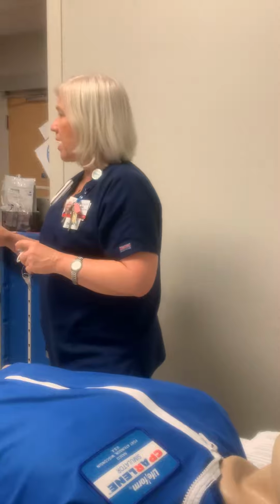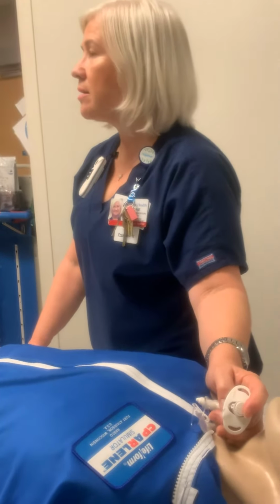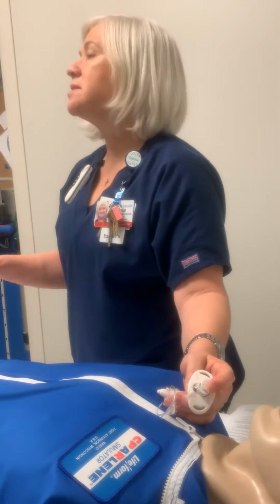And Banner's policy at Gateway is they must have one trach available at all times that is one size smaller than what's in their throat. Okay? So that's our policy here. At the rest of the Banners, they have to have a size that's in currently, but at Gateway, our policy here has to be one size smaller. And if you look at the policy, it speaks to it real clearly. Okay, any questions on that one? Is that clear as mud? Yeah, it's clear.